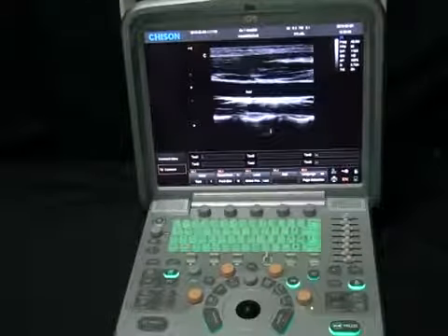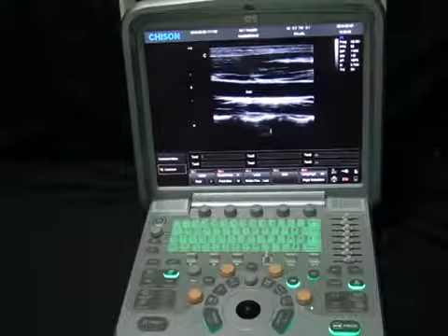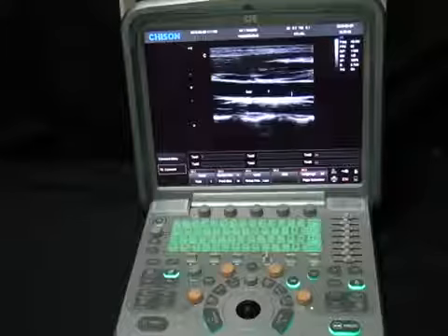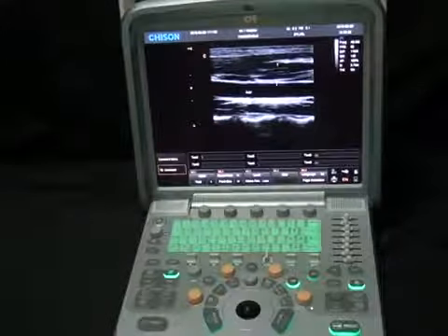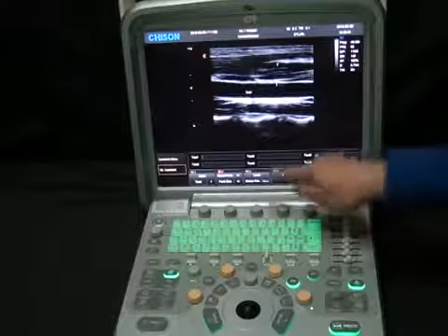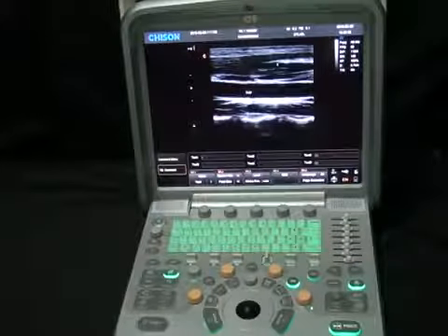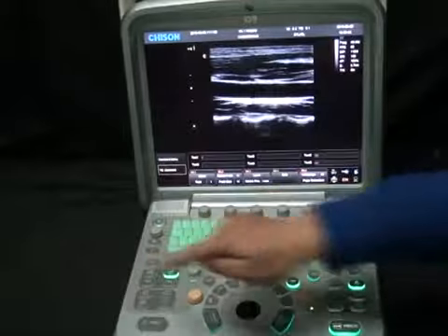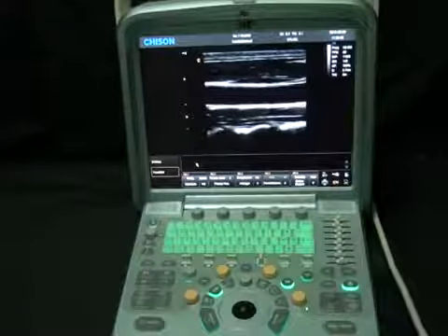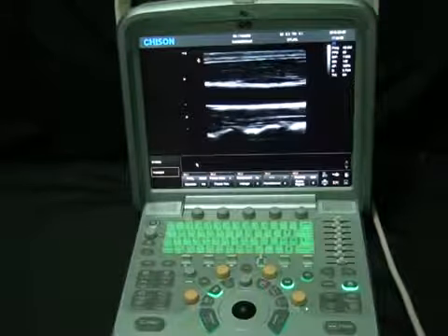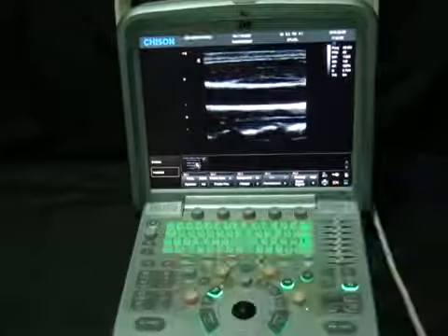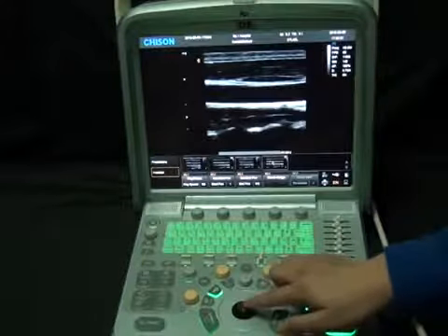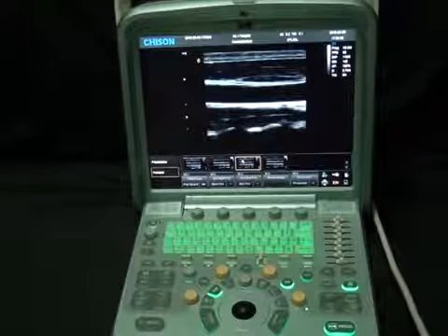To use a quick comment, select the text — for example, Text 1 — and push down to input it; it automatically appears on the screen. Click Enter and you can move it anywhere on the screen and click Enter again. We can change the font size, or reset to the original. Click Load to clear comments, or use the Delete key to clear all comments at once. After the image is ready, press the 1 key to save the image or cine. We can save both in real-time and in frozen status. To recall, hit the cursor button, move to the desired image or cine, and click Enter.